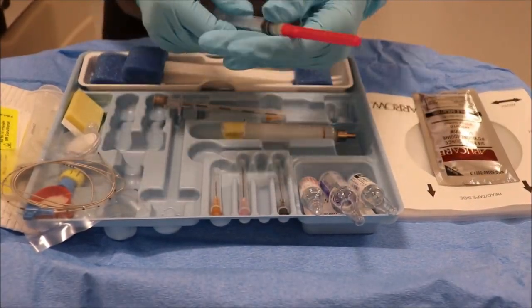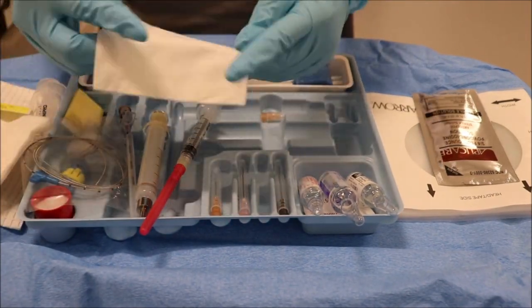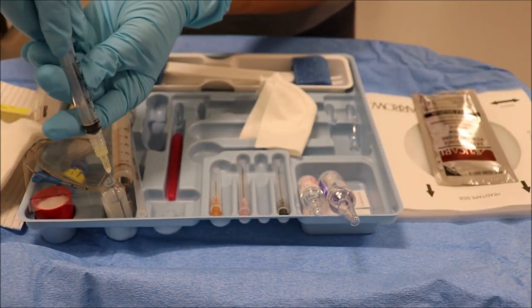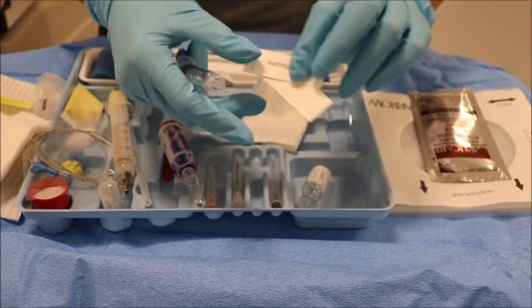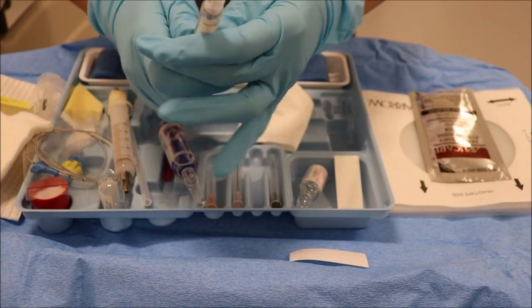Break the glass ampules one at a time and draw the medications into the appropriate syringe with the straw needle. You have 1% lidocaine, which you will draw up in a 3 ml syringe for skin numbing. After you draw up, make sure you label the syringe before putting it down to prevent any possible medication error.